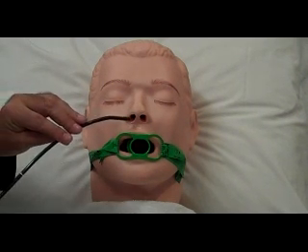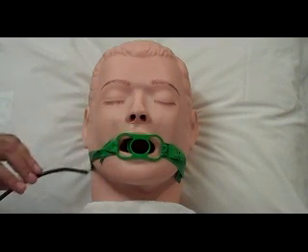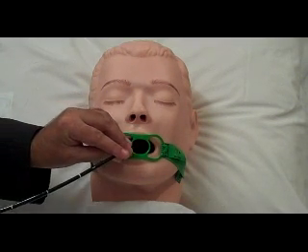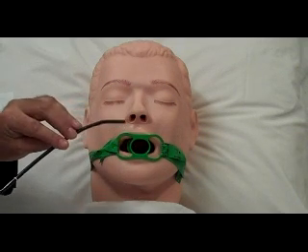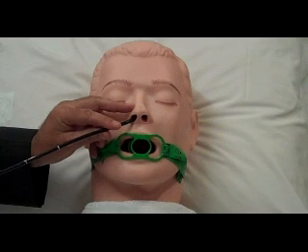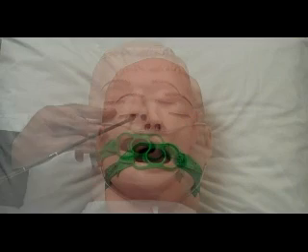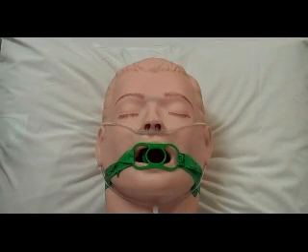I can insert the scope through the nostril or through the mouth using a bite block. When I insert the scope into the airway, I can stabilize the scope at the insertion site. I need to be careful to never poke my patient in the eye. We always give oxygen when we do bronchoscopy.